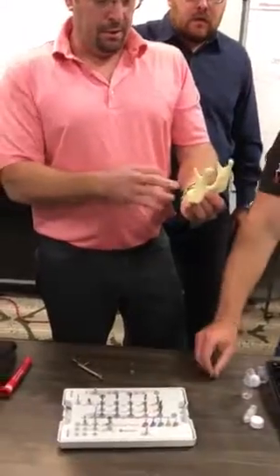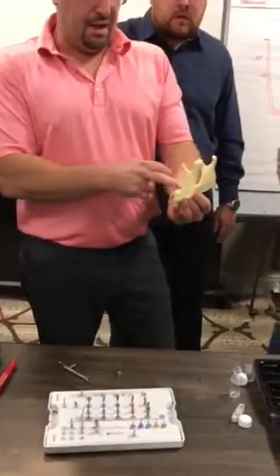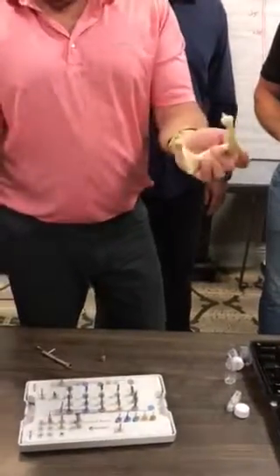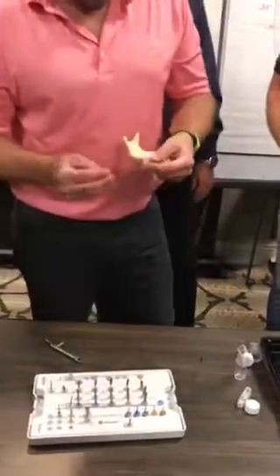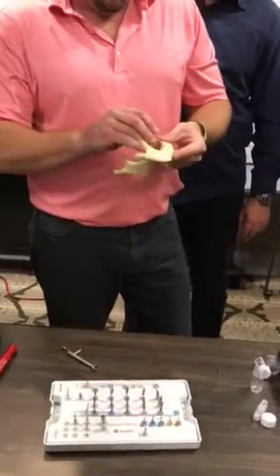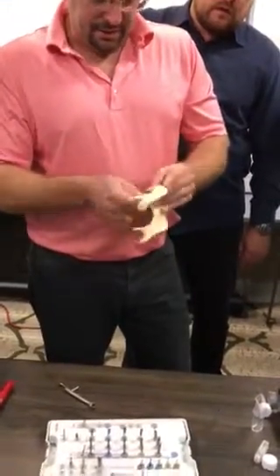So this same type of saw bone — 2mm in the front. This side has the 3-5 drill, this side has the 4-0 drill. Nothing up my sleeves. So this guy, let's get it into a 3-5.